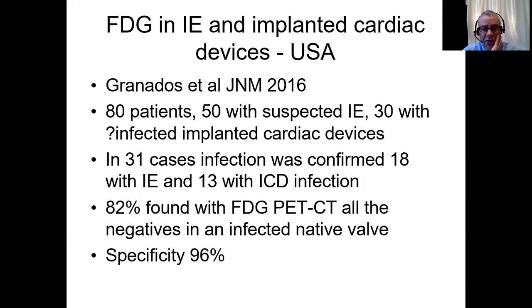And they found that they could, in about half these patients, identify an infection. The sensitivity in native valves was less than it was when there was a device present. This probably is because you get a foreign body reaction around the device as well, but the specificity was very high.